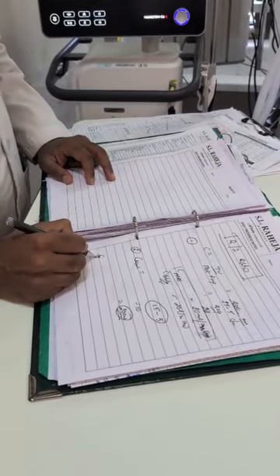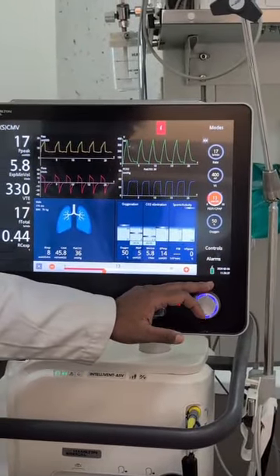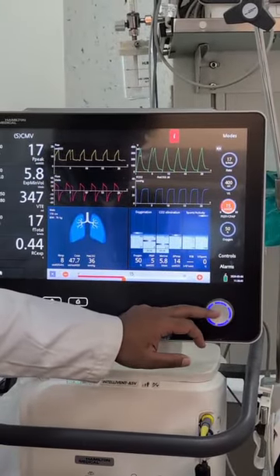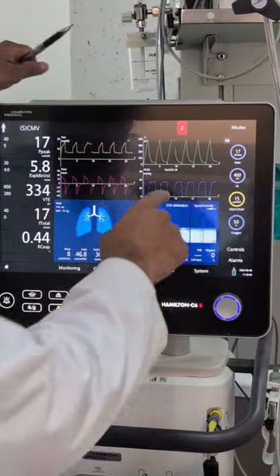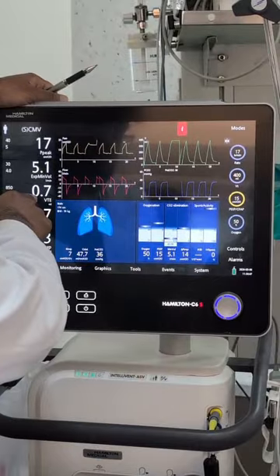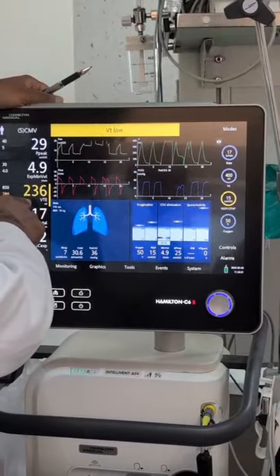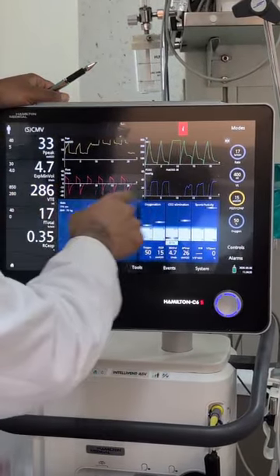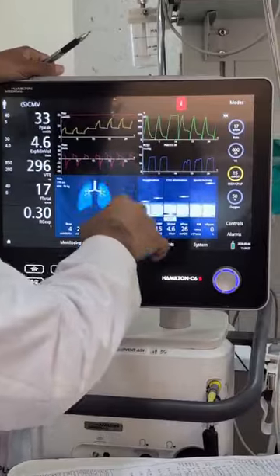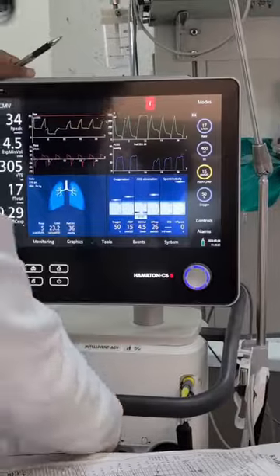But what am I getting? Let us see. So we'll convert this to a PEEP of 15. I kept the PEEP of 15 and I'm going to watch my expiratory tidal volume here. This is the expiratory tidal volume that's coming over here. Can you see the expiratory tidal volume? I hope there is no leak anywhere. It shows a very small leak though. Let's just check this out.